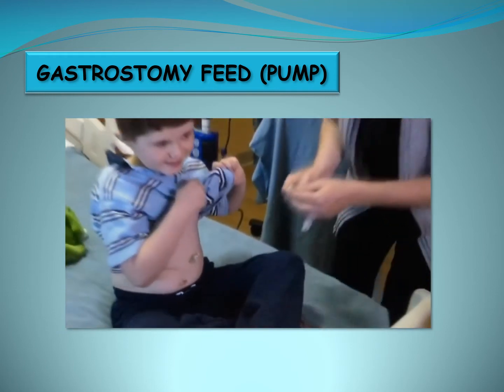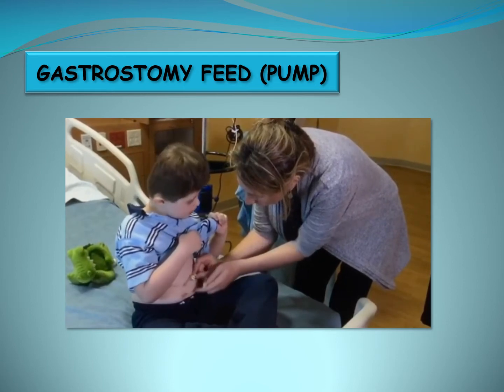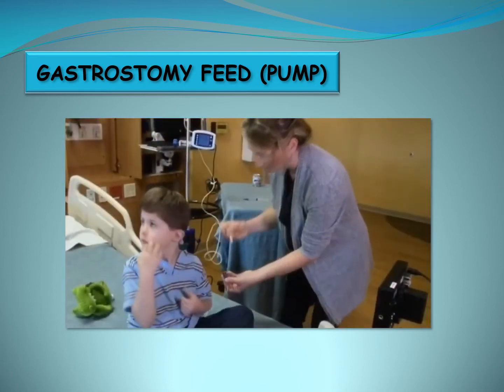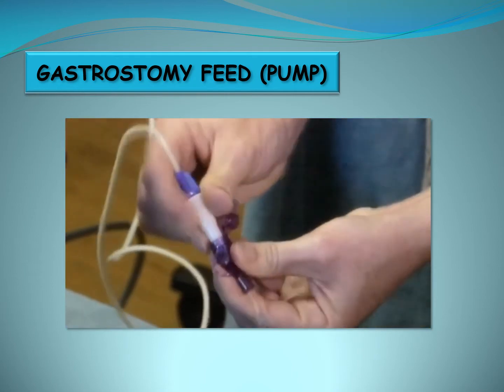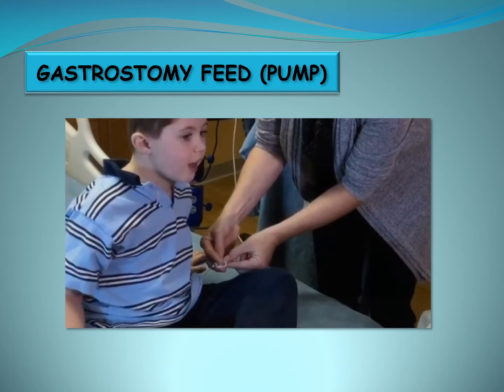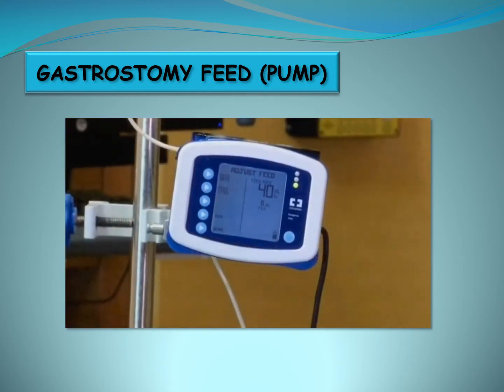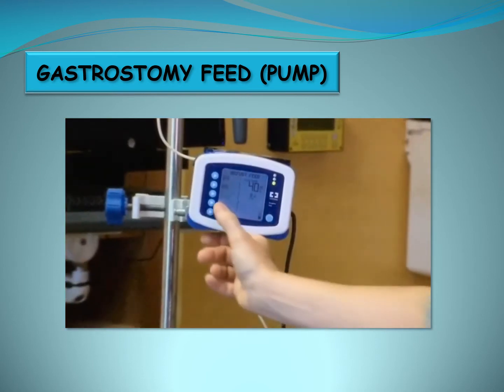Put your child in an upright position if possible. If your child has a button tube, attach the extension set with the clamp closed. Attach the feeding tubing to your child's feeding port. Unclamp the G-tube or extension set. Start the feeding on the pump. After the feeding is done, stop the pump.